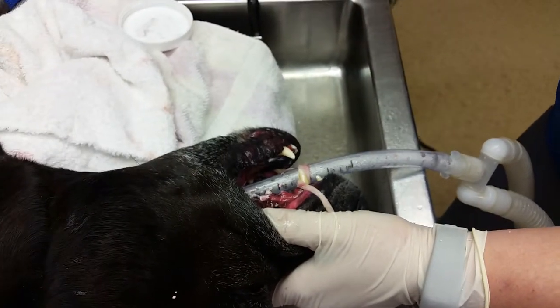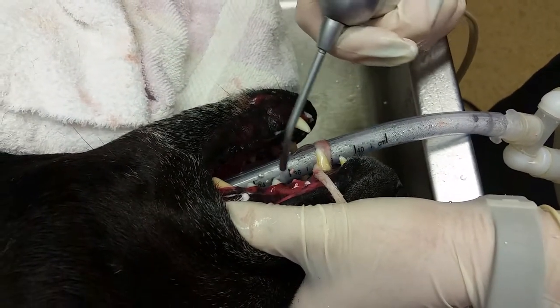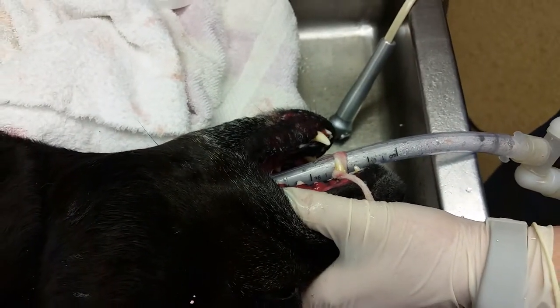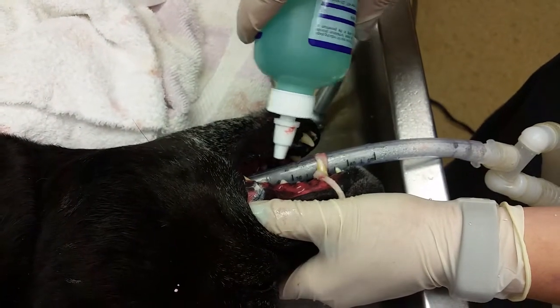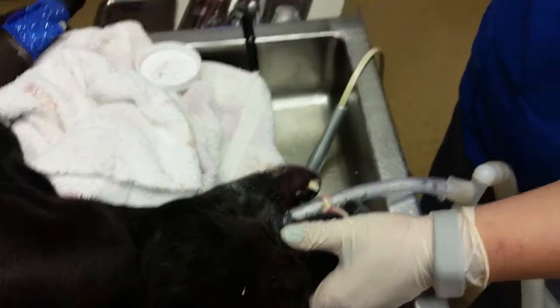I'll go ahead and spray the tooth off with some water and finish by doing a little chlorhexidine rinse to make sure I got anything else that might be left in there. And that should be it for that video. Thank you.